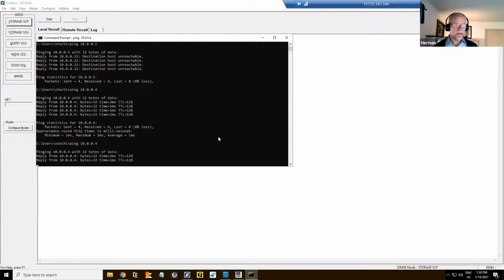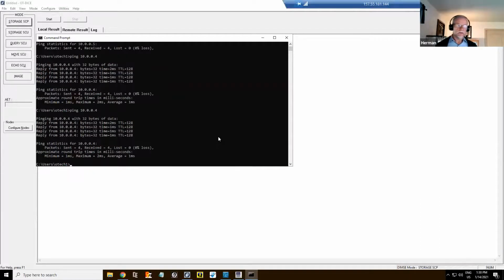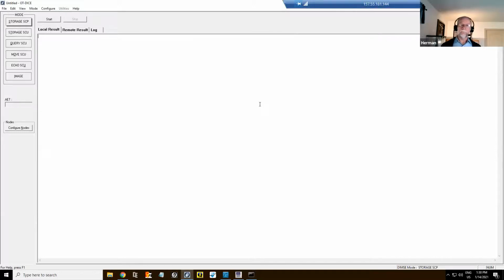So the PACS is at 10.0.0.4. Now remember, these virtual machines are in the cloud, and they have a public network and an internal network. The internal IP address is 10.0.0.4. So I was able to talk from my client, from the simulator, and ping the PACS. Always step one: first ping, make sure we have a network connection, right?